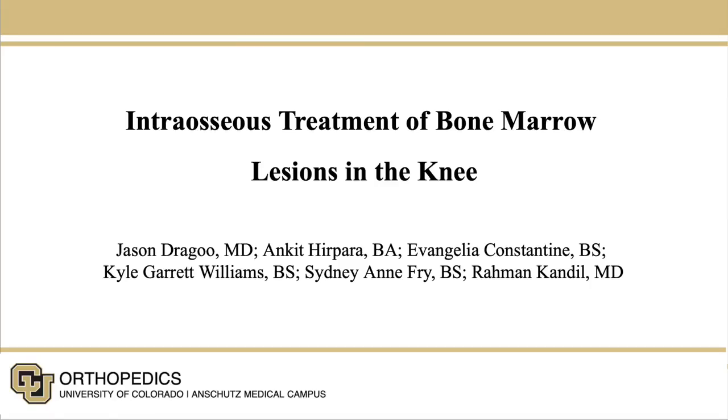This is a video on intraosseous treatment of bone marrow lesions in the knee.